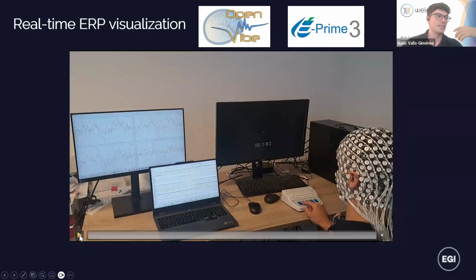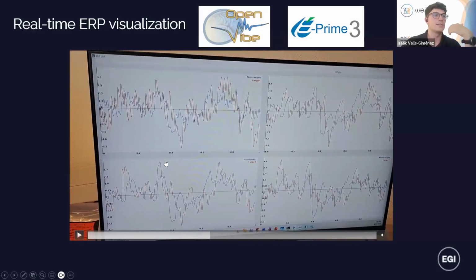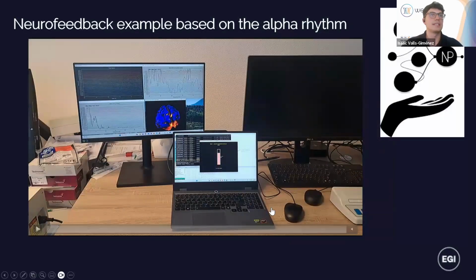So here I have a second video, which is later on in this experiment. We can see later on in the video that we can now clearly see that it's an oddball paradigm. We can clearly see that the target stimuli has a peak more than 300 milliseconds after, a typical P300. So you can see how it looks over time, and you can have it as an optional view for your ERP paradigms.